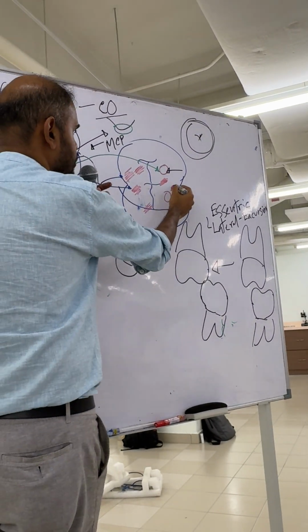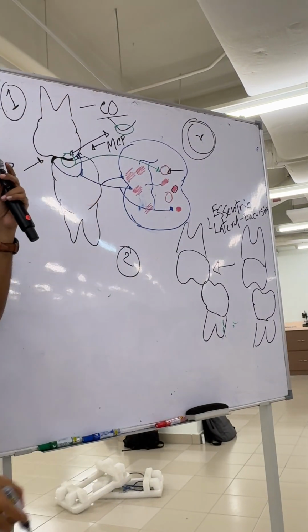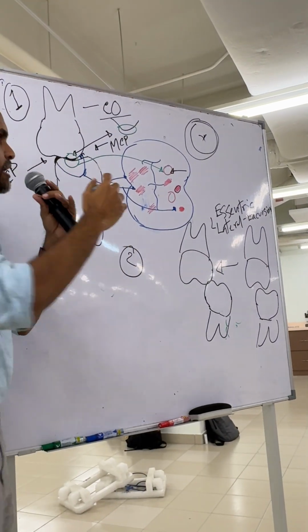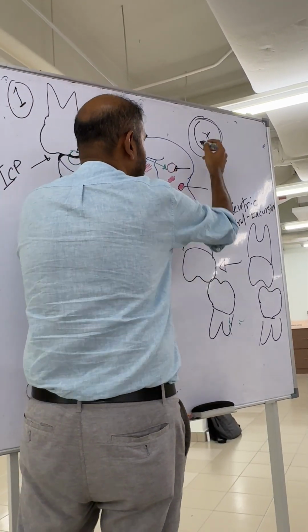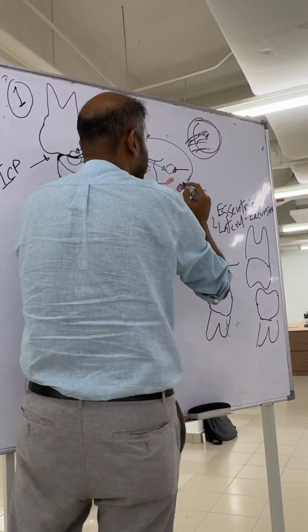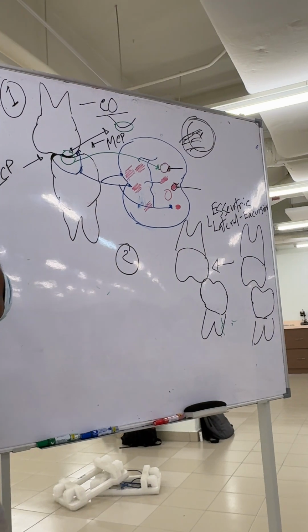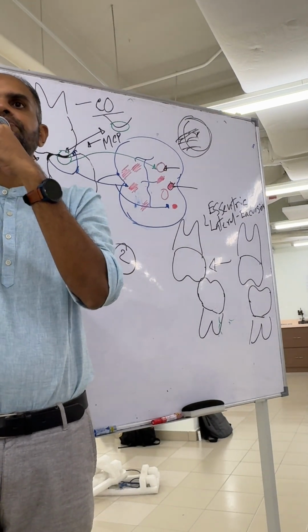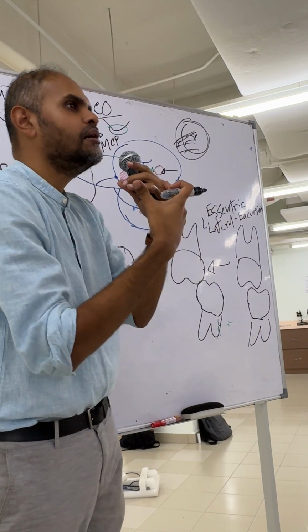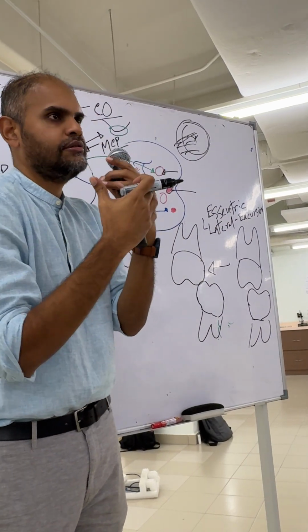Now, this is which one? This is also ideal, but I'm talking about this one, where the inside part is filled, right? Okay, this one. The upper functional cusp and lower functional cusp are properly contacting each other, but they are contacting too much.